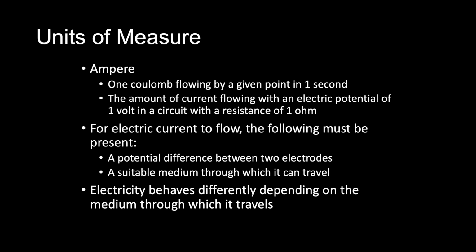In metallic conductors, electrons from the conductor's atoms will move out of the valence shell to a higher energy level just beyond, called the conduction band. And they are free to drift along the external surface of the conductor. Copper is particularly useful as a conductor and is commonly used as such in electronic devices. Other metals with this characteristic are used extensively in X-ray machines and also in the X-ray tube design.